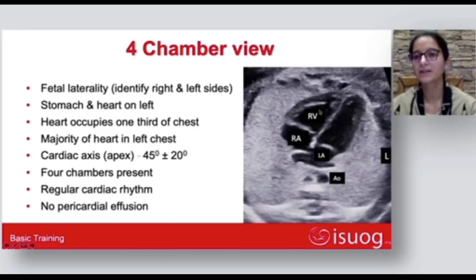The two ventricles, as you see here, are separated by this interventricular septum, and the interventricular septum, the tricuspid valve, the mitral valve, and the septum primum join in the center of the heart to form what is known as the crux of the heart. The normalcy of the crux of the heart is very reassuring, as it helps us in excluding several abnormalities.